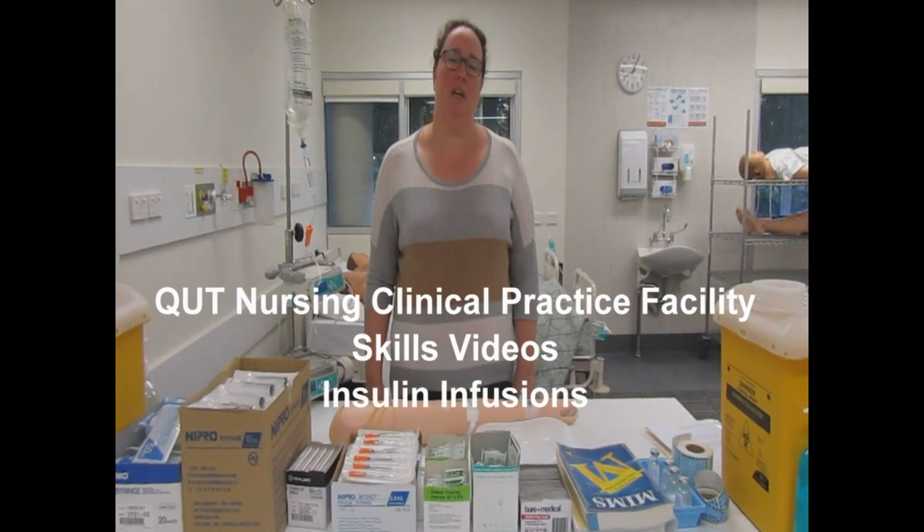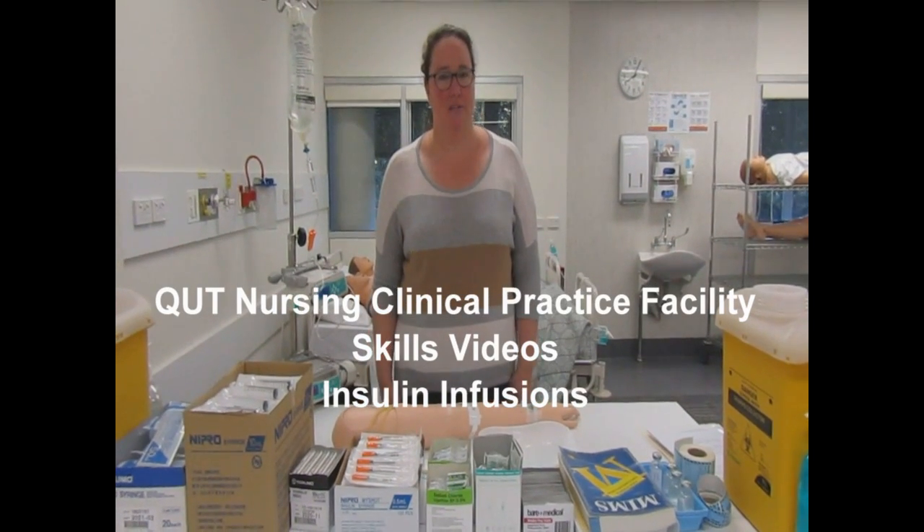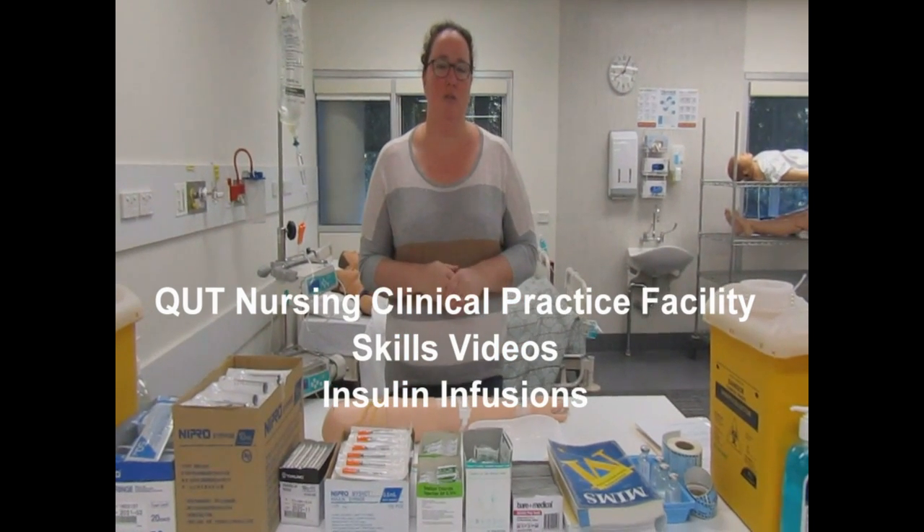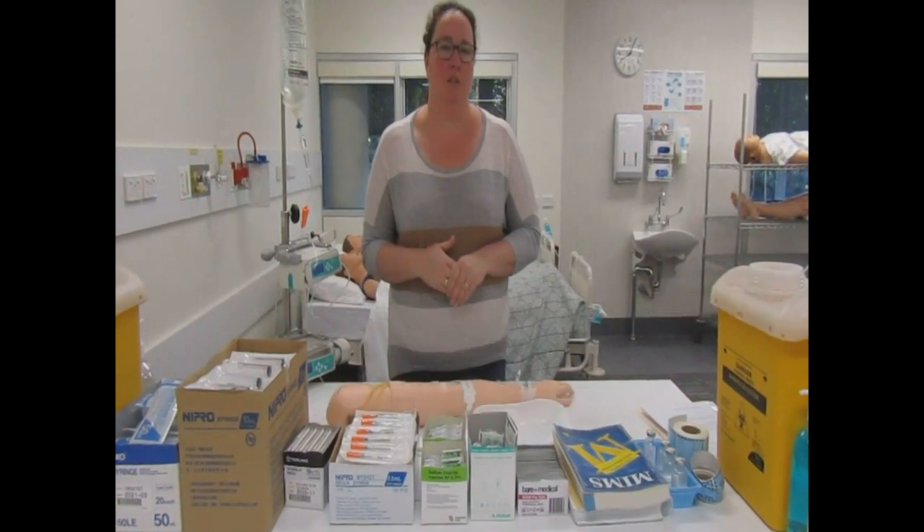Hi, my name's Jodie and I'm here at the QUT Nursing Clinical Practice Facility. I'm going to demonstrate, using the equipment in front of me, how to draw up an insulin infusion for our patient.